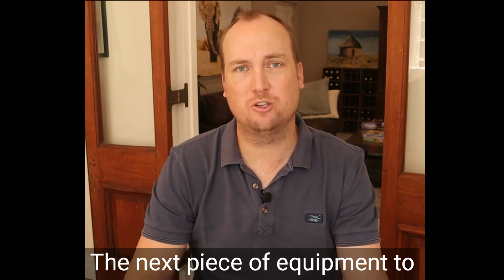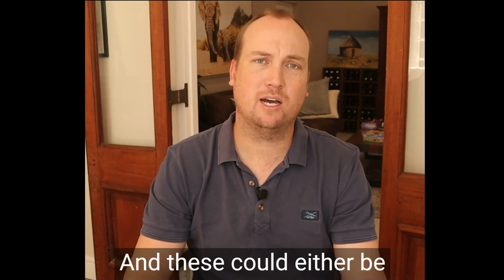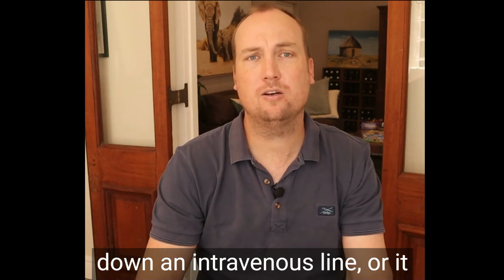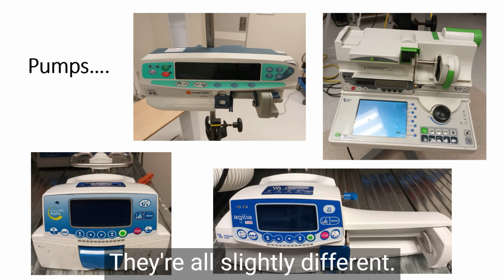The next piece of equipment to check is the equipment for giving controlled intravenous infusions. These could either be pumps that control infusions down an intravenous line, or it could be a syringe driver pump. And again, there are lots of different makes. They're all slightly different.